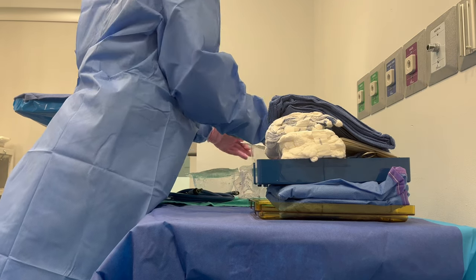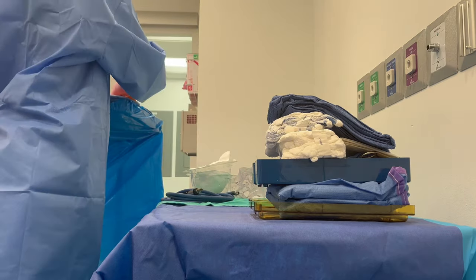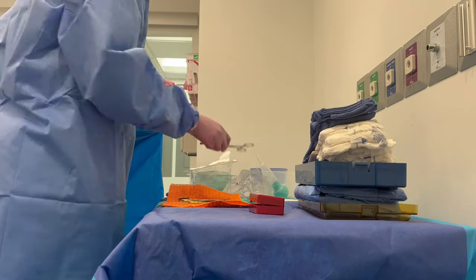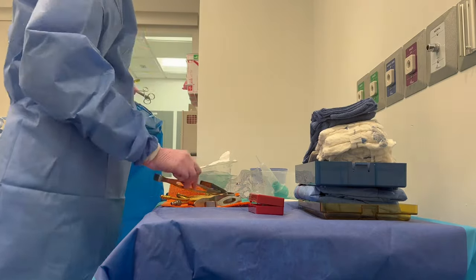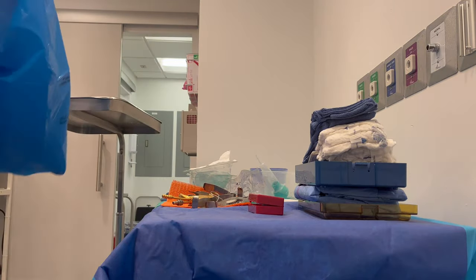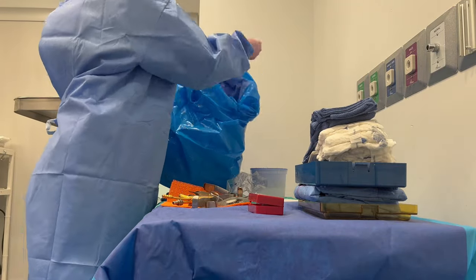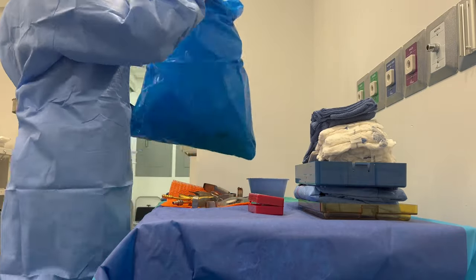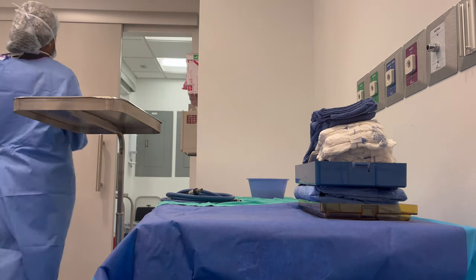I usually just work off my Mayo. On the side here, I have laps that I didn't use and towels that I didn't use. Like I said, it's a smaller practice, so we do reprocess those items, not to use in surgery again, but to use in our local procedures, like when a patient comes in for Botox or a local mole removal. But never again in surgery, obviously. It just keeps the cost down and avoids throwing things away, so we re-sterilize them and use them for smaller procedures around the office and skincare.